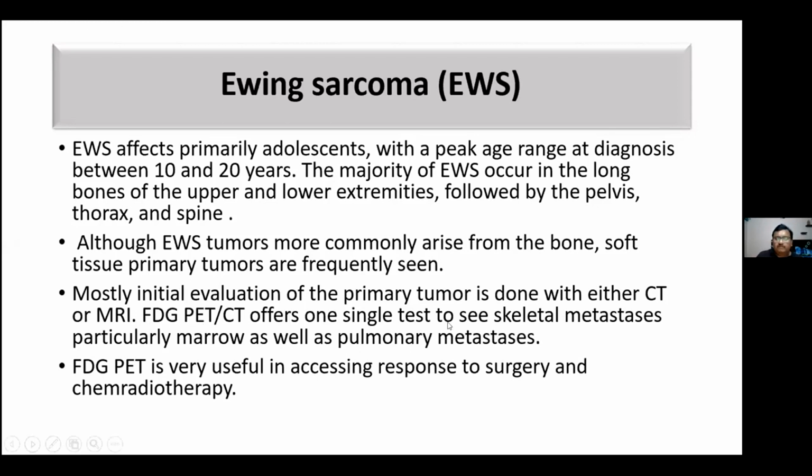FDG PET CT offers one single test to see skeletal metastasis, particularly marrow, as well as pulmonary metastasis, very common in Ewing's. And FDG PET is also very useful in assessing response to surgery and chemoradiotherapy in Ewing's, which is a sensitive tumor to chemoradiotherapy.